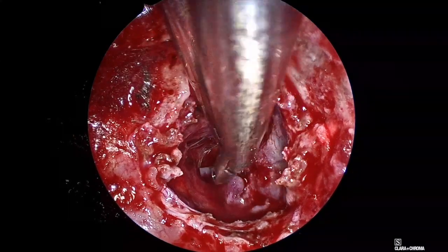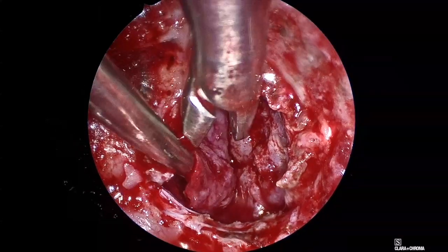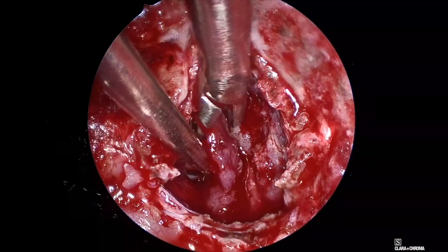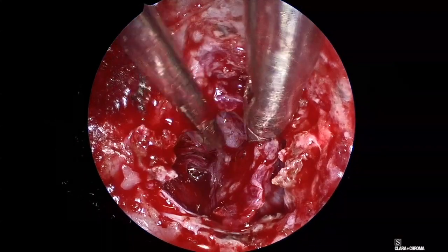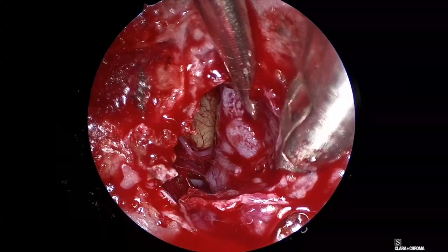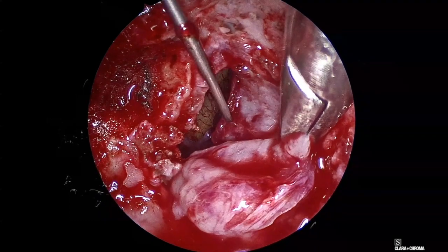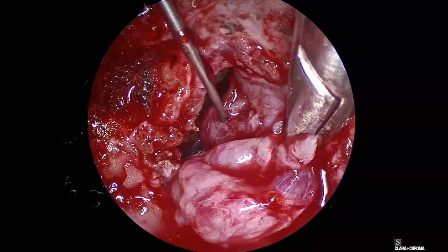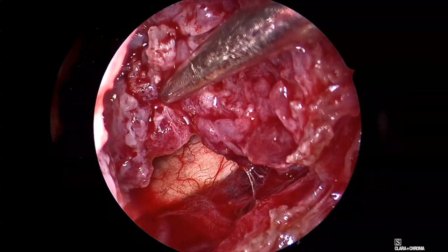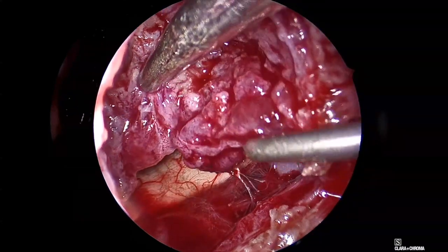Aided by the optics of rotating the 30-degree scope, the tumor was gently rolled towards the center with angled instruments, keeping the suction tip as a counter traction to avert any neurovascular injury. The arachnoid over the pituitary stalk was preserved along with hypophyseal vessels.